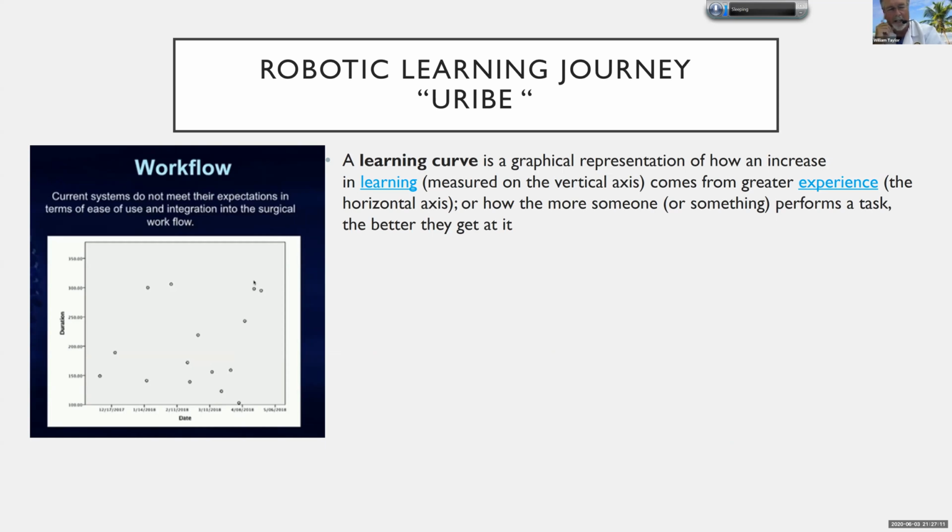He really has an excellent talk. The robotic talks seem to fall into two different categories: either somebody giving you a lot of information about pedicle screw accuracy and cost savings, or some people talking just about the philosophical parts of the robot. And basically what Juan found out in looking at his first cases, these are the first 20 cases or so, is that they were all over the place. And he can really tell you why he thinks that is. But I would tell you that the learning curve on the robot is not smooth, nor is it typical.